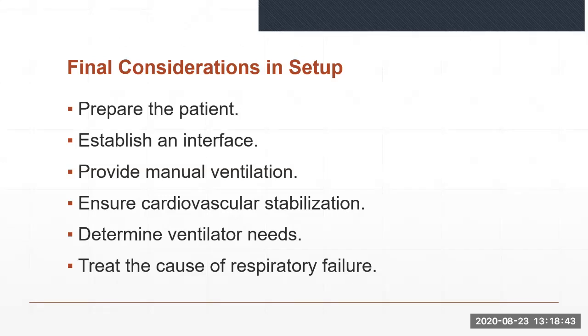In preparing the patient, mental preparation of a patient who will require mechanical ventilation is an obvious part of preoperative planning for patients that will likely need short-term postoperative ventilatory support. It is an important part of patient preparation because it can significantly reduce the patient's anxiety and discomfort. Before initiating mechanical ventilation, conscious patients must be prepared for what to expect once they are connected to the ventilator.